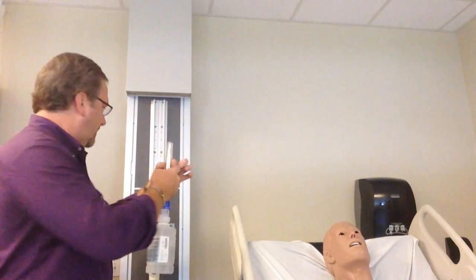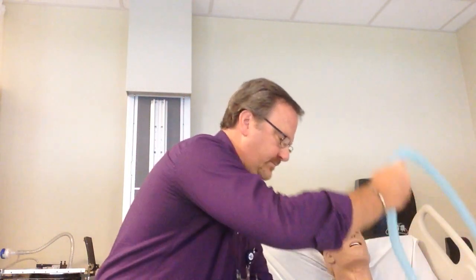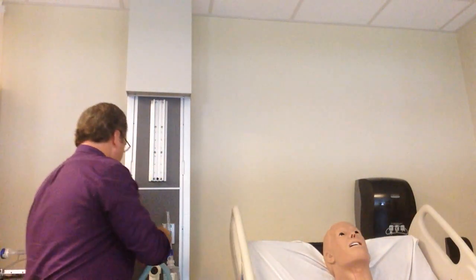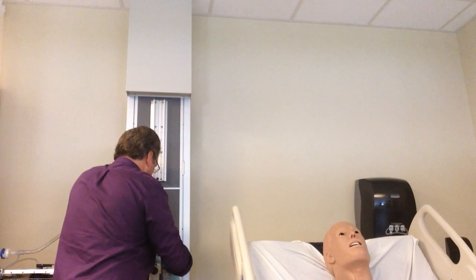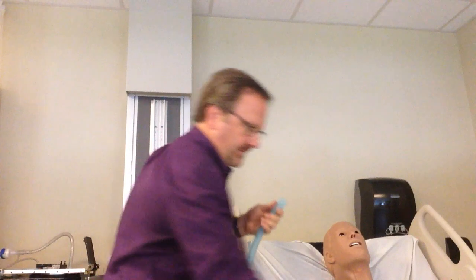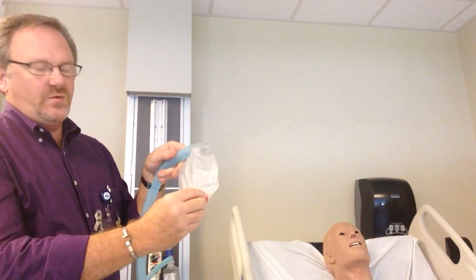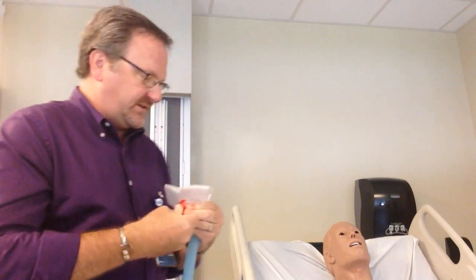I'm going to connect this to the wall where it would have already been. Then I take my first section of corrugated tubing and connect it. That is now connected. I take my drainage bag and connect it. This is for draining the water out — when water gets in here, as you go around and assess your patients, you'll need to drain it into a glove, a garbage can, something.